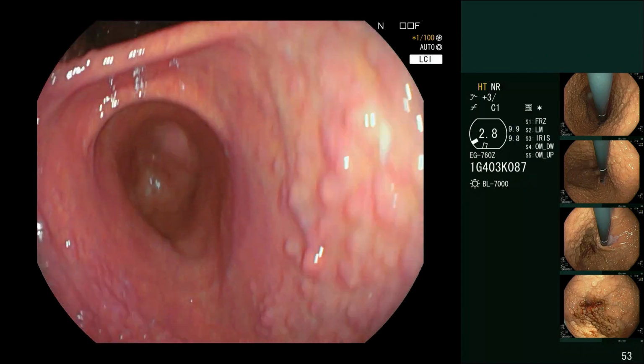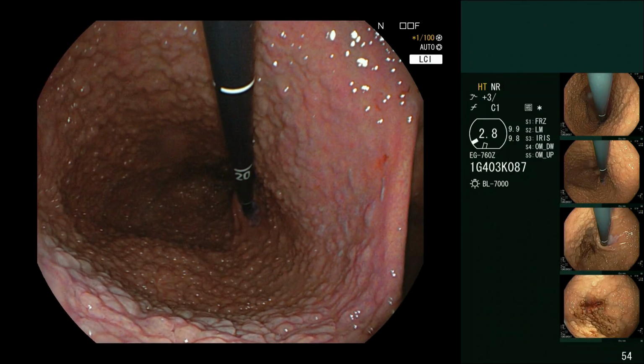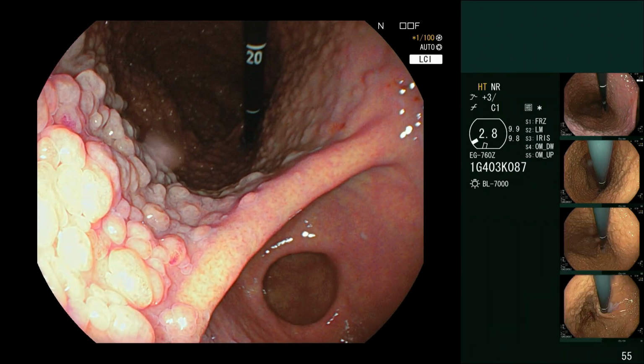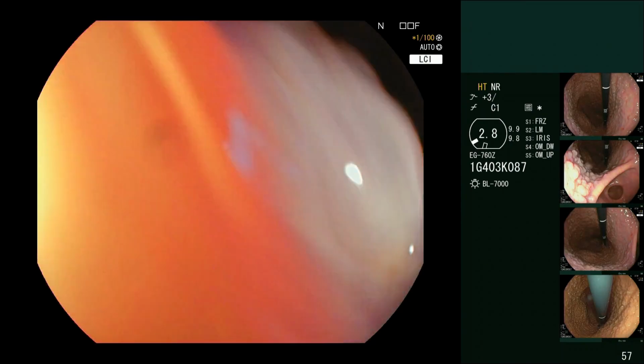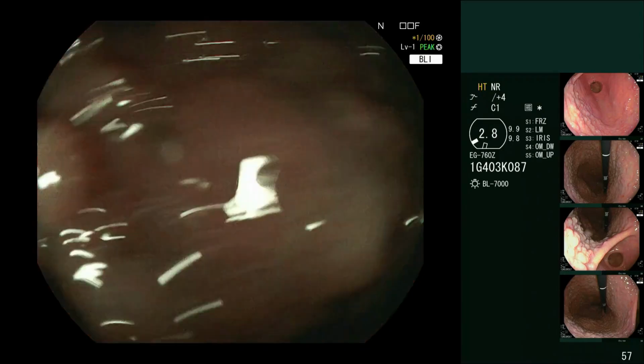Okay, right? And again, we want some standardized photographs. If you can get a photograph which takes all this in one, then I think it's a very useful localization photograph later if you find something else. Okay, and then once we've done all that, anything that you find that is looking suspicious, you characterize.